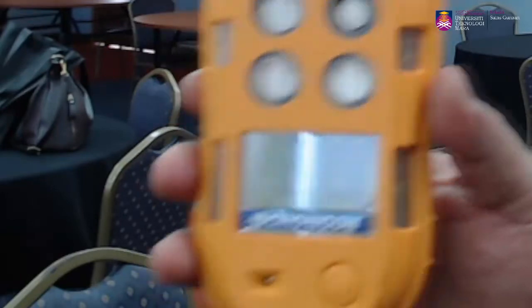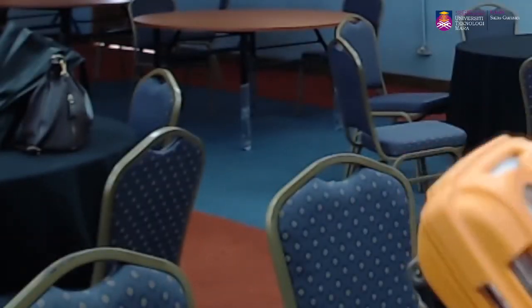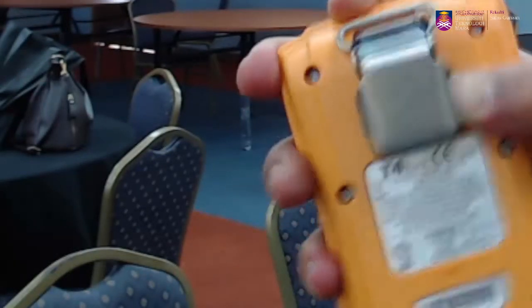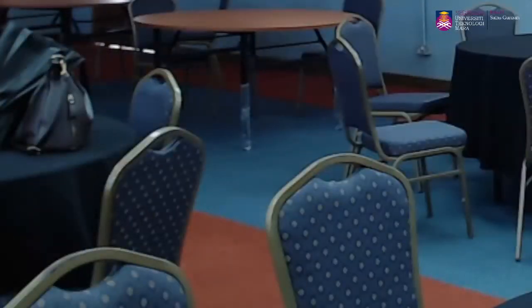Yes, just let it run. Okay. So for this unit it's just basic use, so there's nothing difficult about its usage. Usually, we clip this behind here onto our shirt. For example, usually does it need charging or how? Charging is available. Okay, we will go through the charging part. The box is over there.